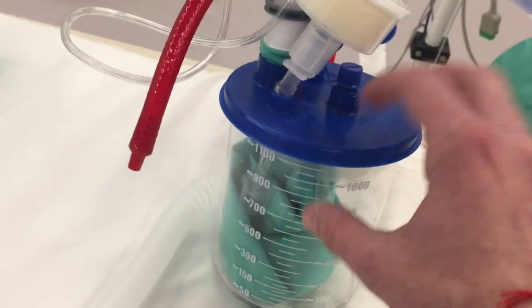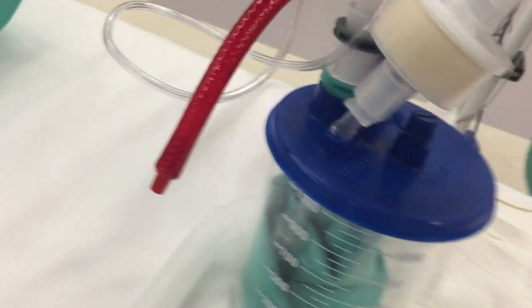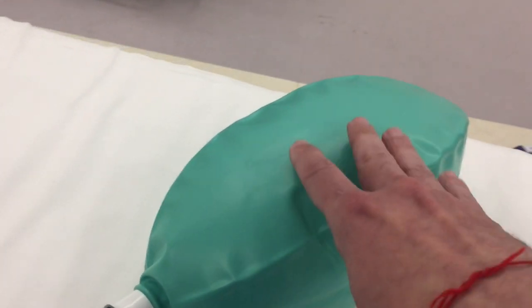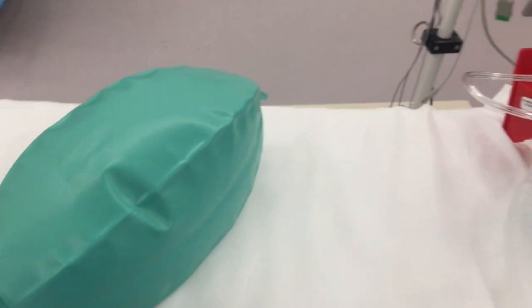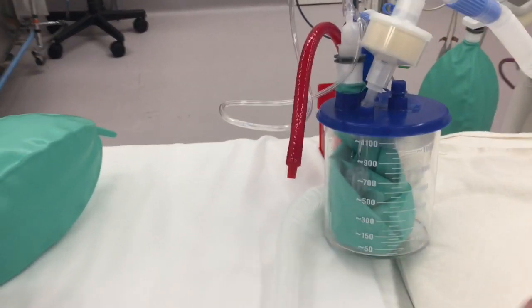When the ventilator pressurizes, it pressurizes this canister, squeezes down on the bag, and it ventilates the patient through this long limb, through the ambi bag — and this is our patient here. So you can have multiple canisters set up for multiple patients.